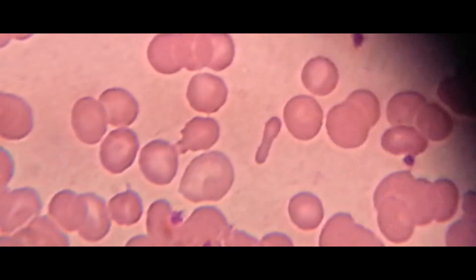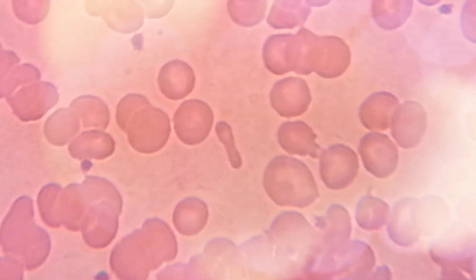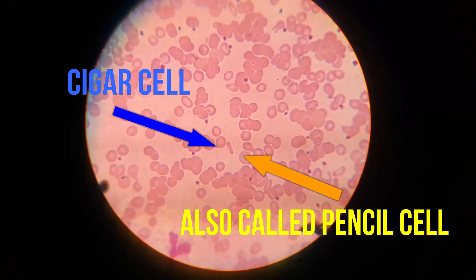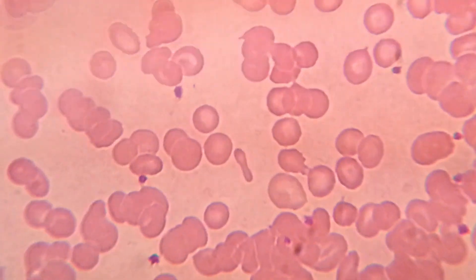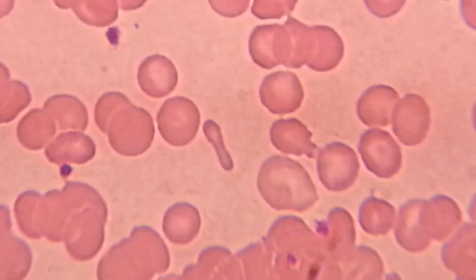Cigar Cell or Pencil Cell at Center. Here you can see on Peripheral Blood Smear a Red Blood Cell that is Cigar or Pencil shaped.